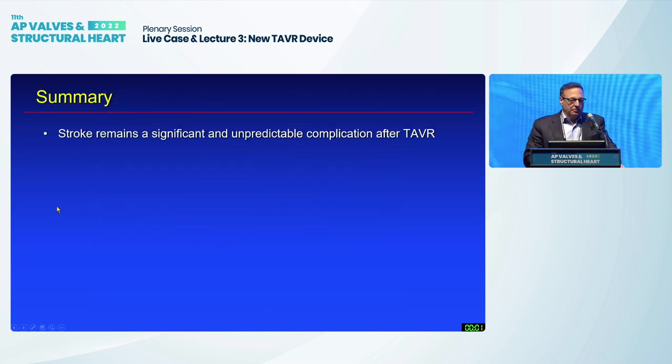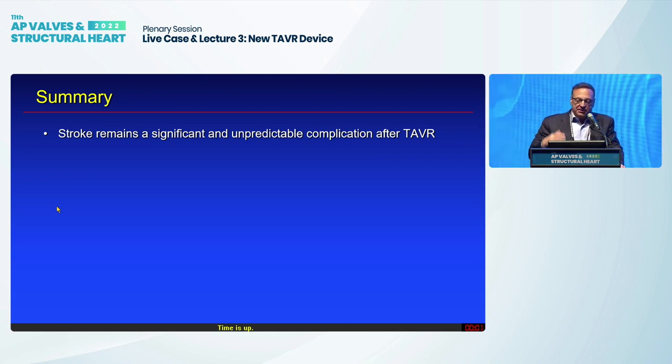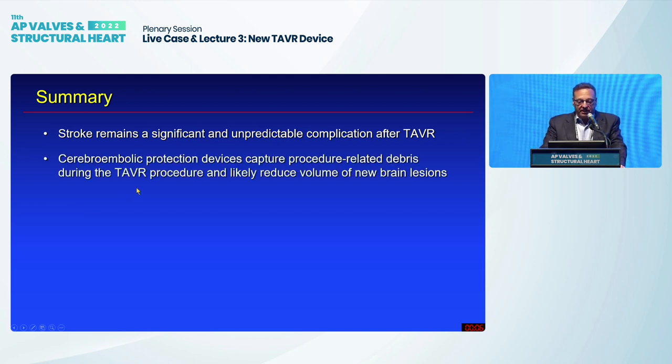So just to leave you with a couple of take-home messages, I think it's very clear that stroke remains a significant and importantly unpredictable complication after TAVR.